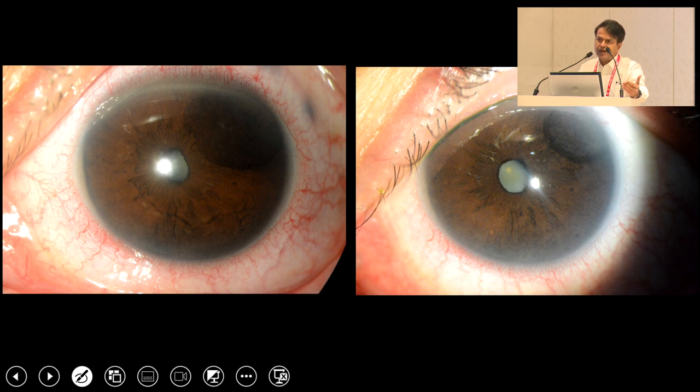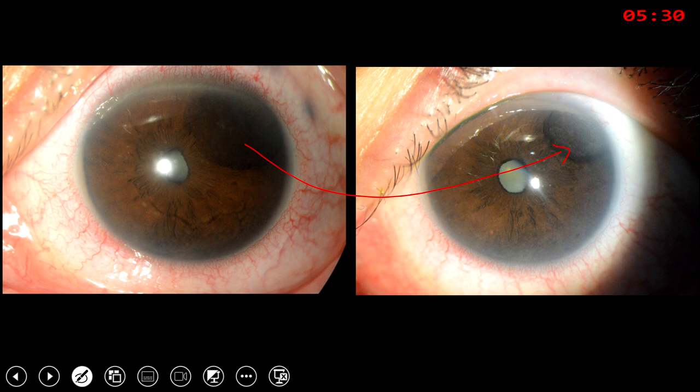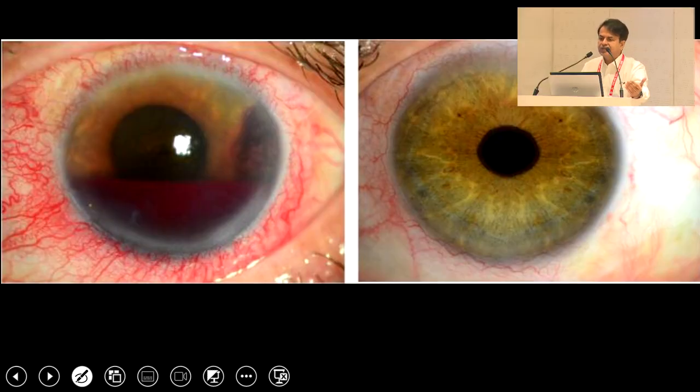The effect of plaque comes very slowly. This was a ciliary body tumor with iris extension. You can see that after about 12 months, the tumor has reduced in size, and it will never be a flat scar in uveal melanoma. It will always remain a small, stable scar. So that is the final outcome. You'll never see the tumor disappear in uveal melanoma. It will become smaller, whereas in OSSN and retinoblastoma, the tumor generally disappears.